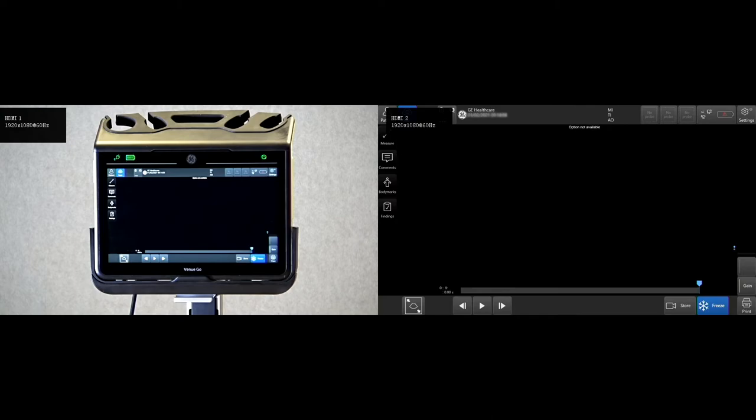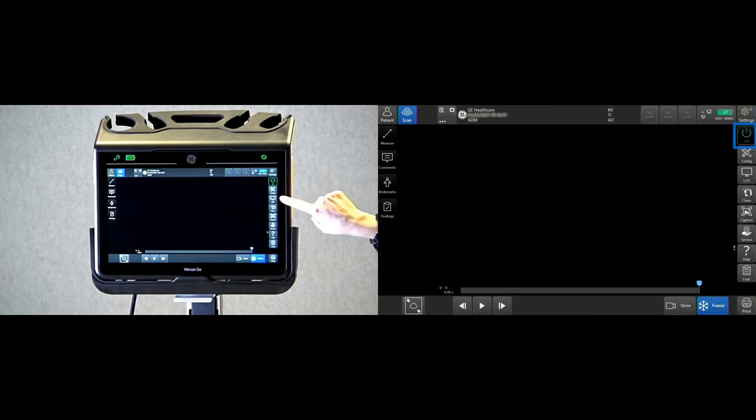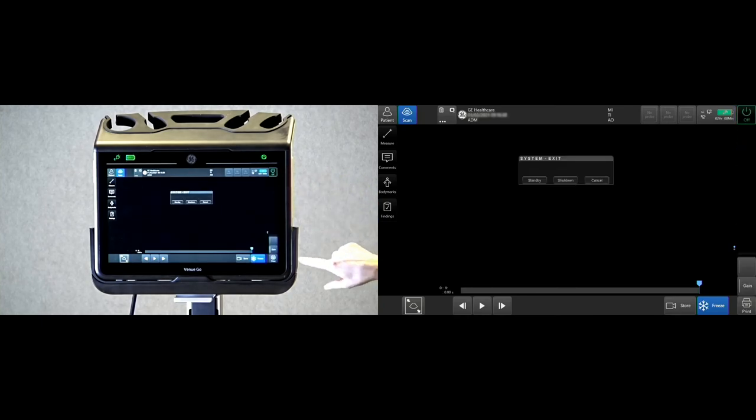To shut down or place the system in standby, press the power button. If standby is chosen, the system will reboot in six seconds. When shutdown is selected, the system will reboot in about 40 seconds. If the power button did not respond when attempting to shut down, tap settings and tap off. This option is configurable.